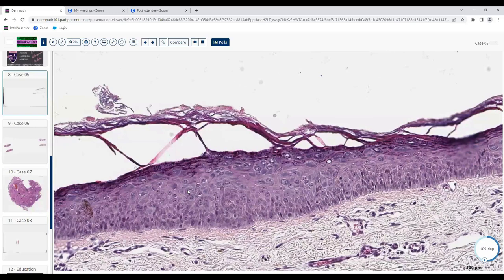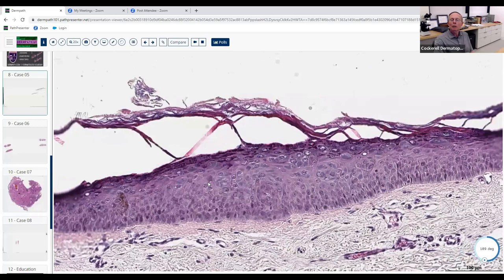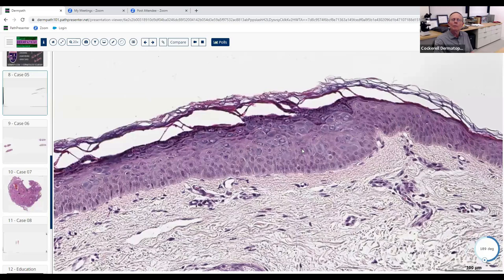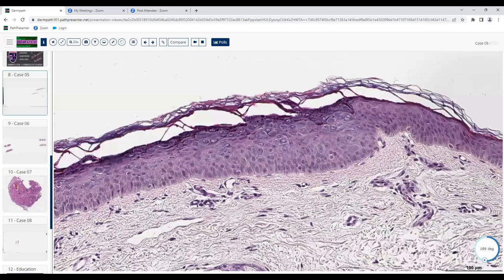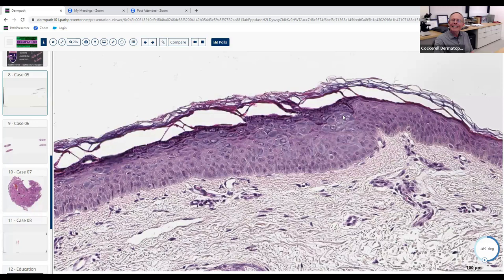For what reason? Zooming in, there was a bunch of atypical blue-gray cells right under the granular layer, and I also thought there was nuclear pleomorphism and maybe some mitotic figures. It could be malignant — and it would be pretty early malignancy, confined to the epidermis. Tell us more about those cells — they look like they have a lot of cytoplasm, they're large and atypical. What does that blue-gray appearance imply to you?